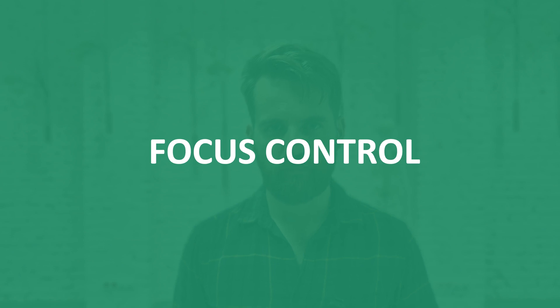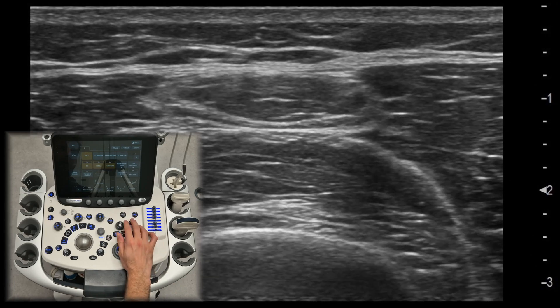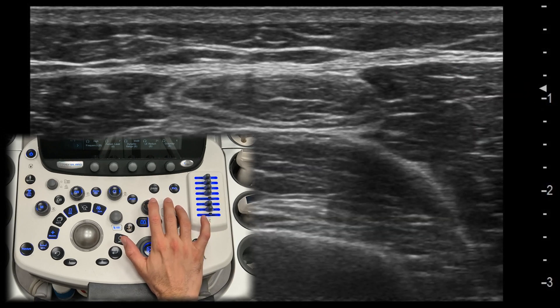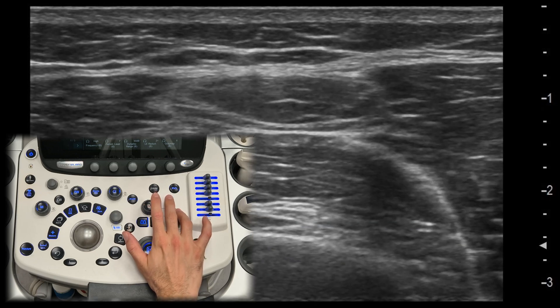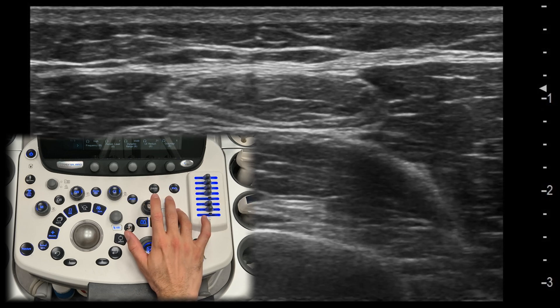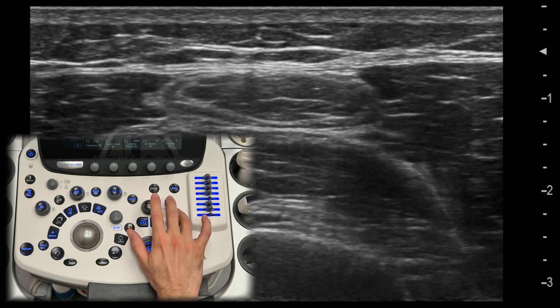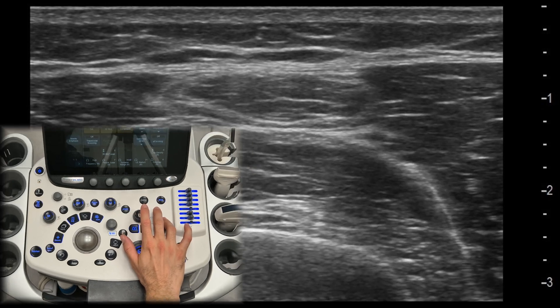Focus control. The focus control helps you sharpen the area of interest in your scan. In ultrasound imaging, the focus is usually indicated by an arrowhead or marker located along the centimeter scale on the side of the image. It adjusts where the ultrasound beam is most concentrated. Make sure the focus is placed at or just below the area of interest. You can increase or decrease the depth of the focus depending on whether you want to scan superficial or deep structures.